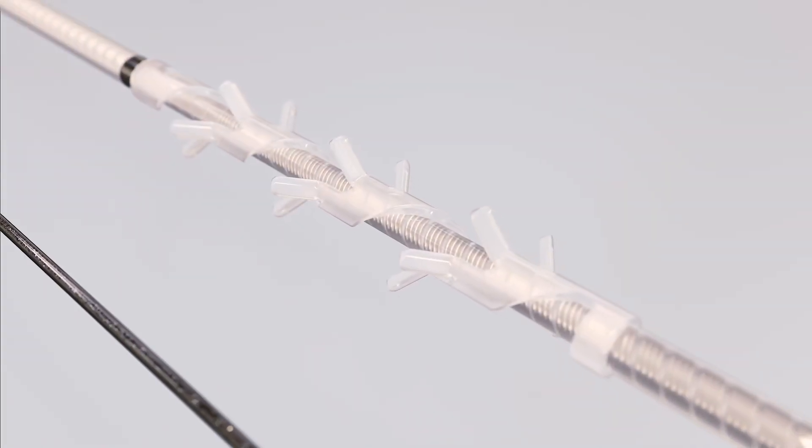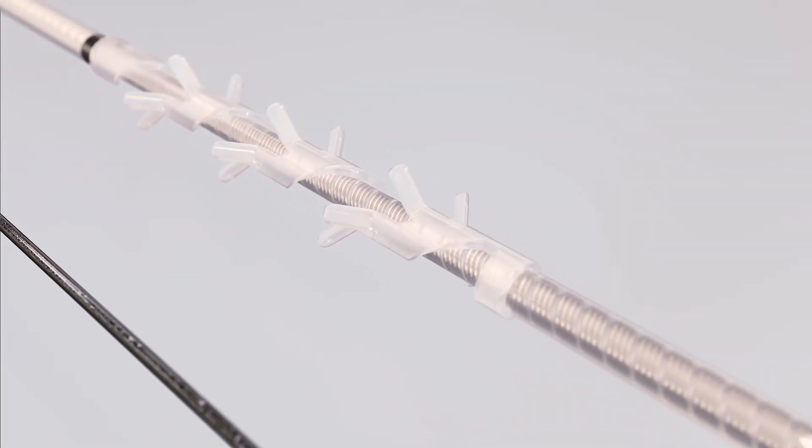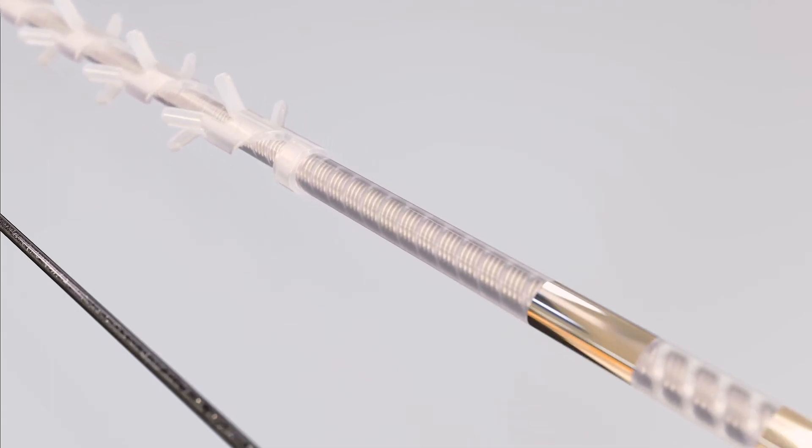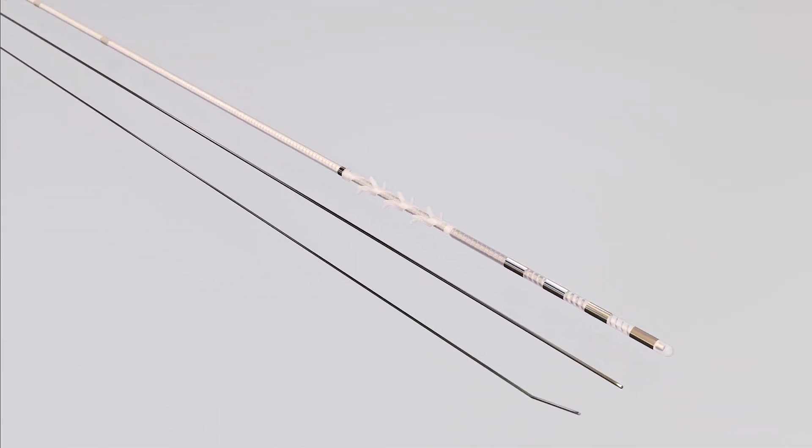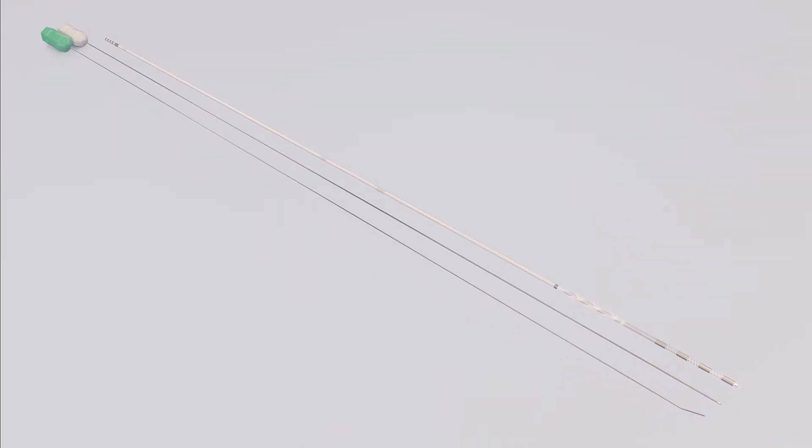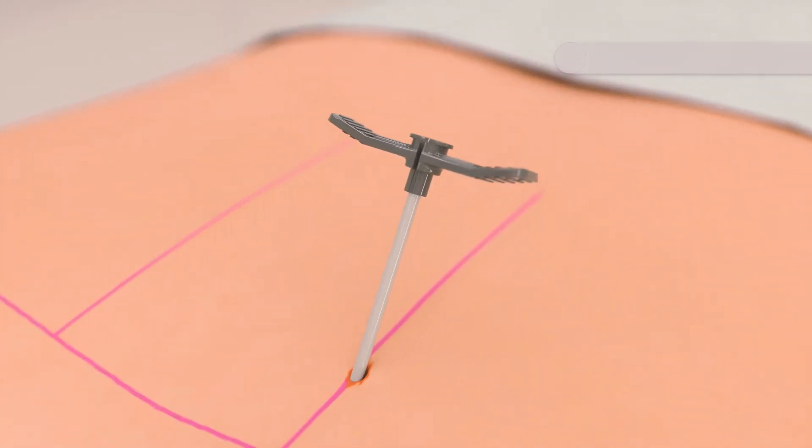This tined lead is packaged with straight and curved stylets. The curved stylet has an angled tip which allows for better tracking of the lead along the sacral nerve root. The lead is introduced such that the angle of the curve will be directed in a caudal and medial to lateral fashion so as to follow the path of the nerve.